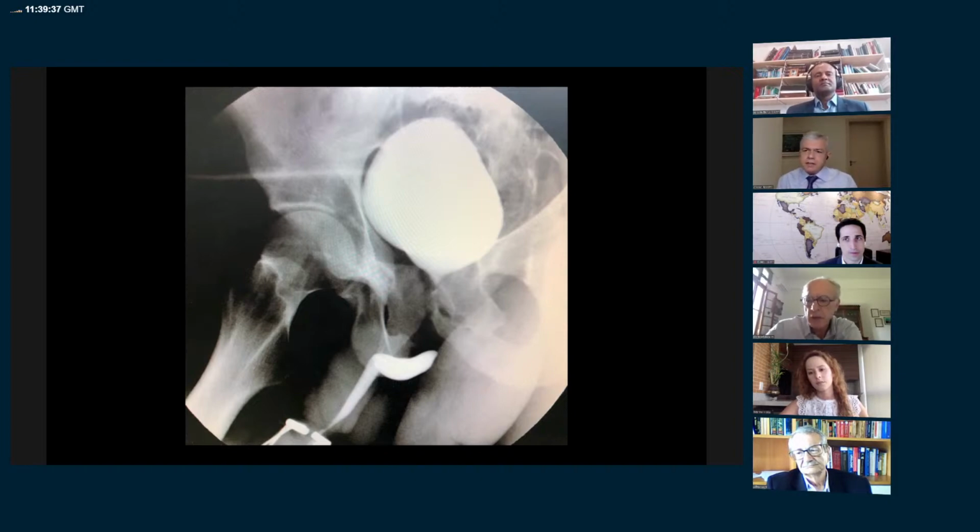And about the continence, are you comfortable with the images presented by Marina and described by Professor Lahe about the sphincter assessment? Probably the continence will be maintained by the proximal urethra, bladder neck and proximal urethra. The membranous urethra and the sphincter in this region is out. When you perform the urethroplasty, all this tissue you need to remove. But in most cases, the patient can maintain continence.